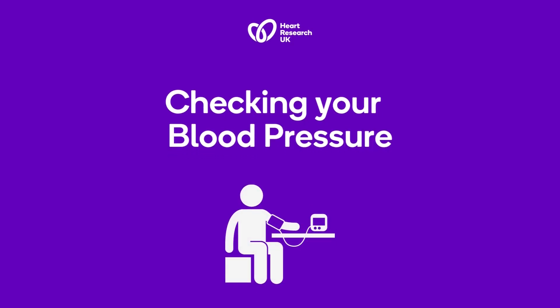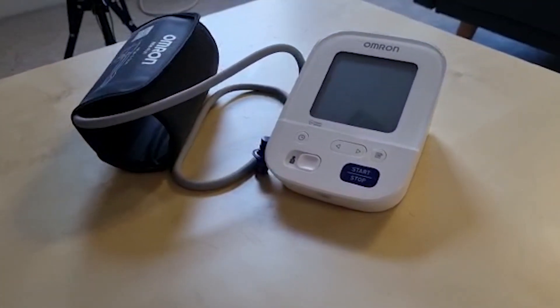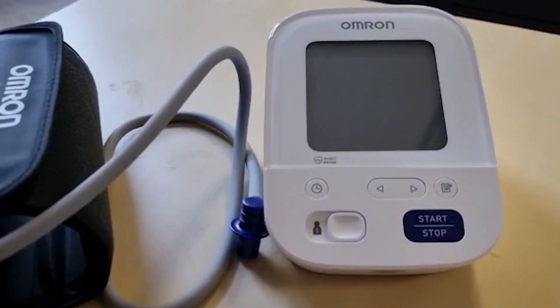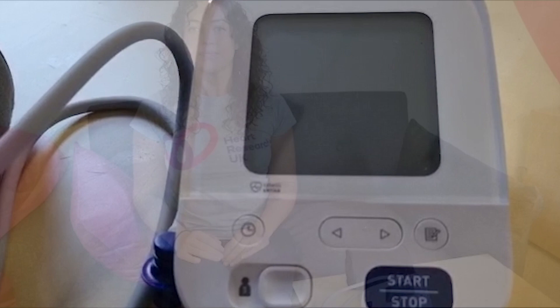We know that high blood pressure or hypertension increases the risk of serious problems such as heart attacks and stroke if left untreated. It is therefore important that we get our blood pressure checked or check it ourselves. This short video will show you how to take your own blood pressure and how to read the results.